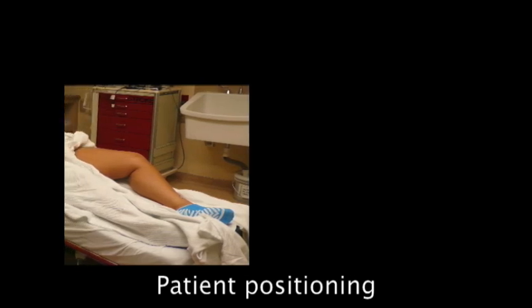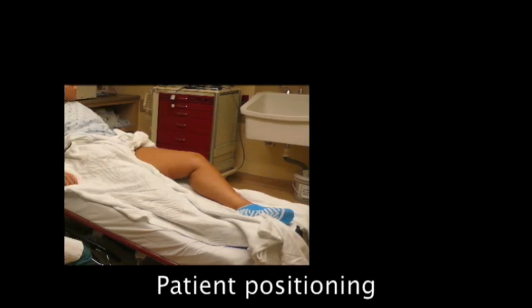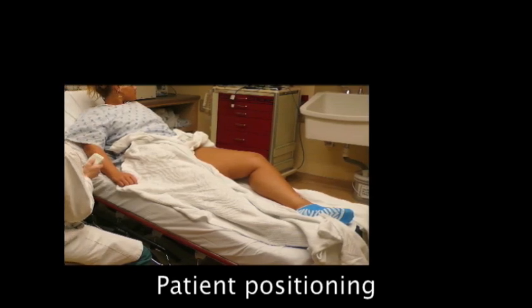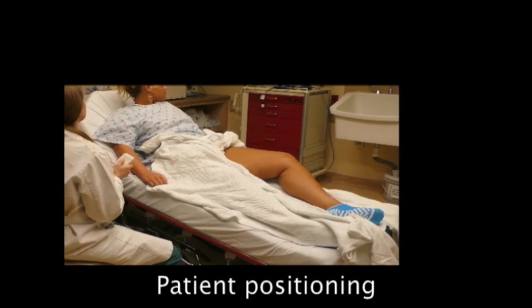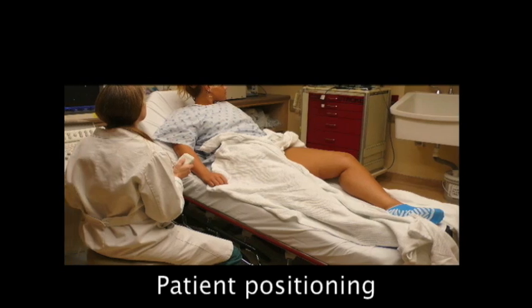The patient is placed in the supine position with the affected leg slightly bent at the knee and externally rotated, providing optimal access to the medial thigh. The patient is undressed from the waist down with the inguinal region and affected leg exposed. Reverse Trendelenburg is also useful to improve diagnostic accuracy by increasing the blood volume in the legs.